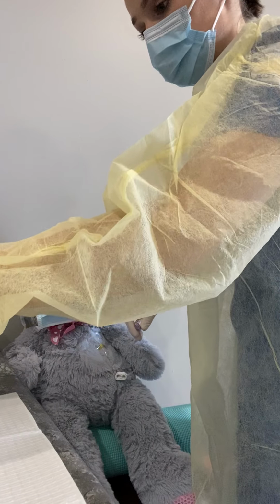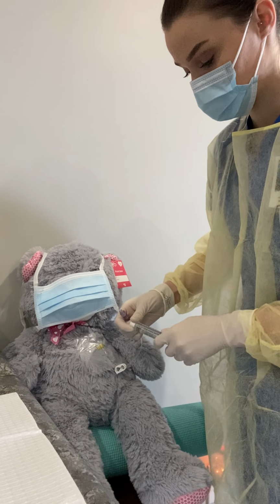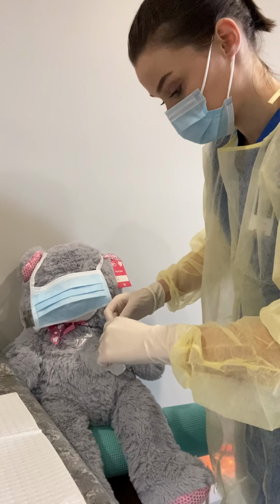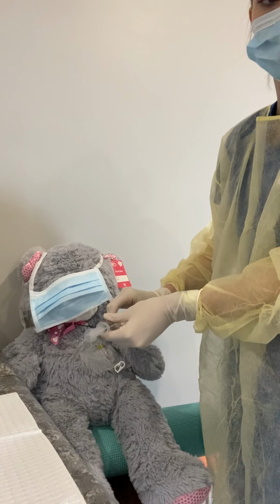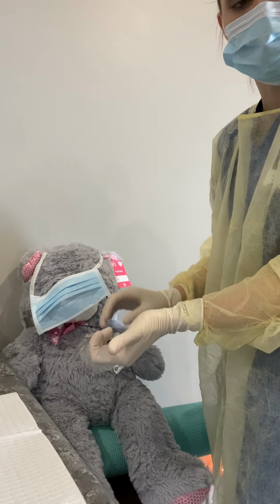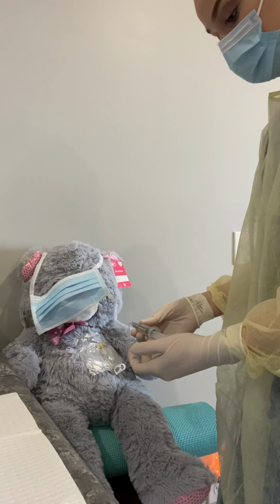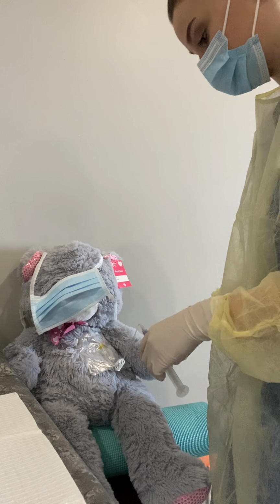And then I'm going to get my normal saline. Going to open that. Make sure there's no air. And I'm going to connect that. So I've got my normal saline connected. And I'm going to flush this 5 cc's or whatever, 5 or 10. Flush, flush, flush. It's patent, we've got it all good.